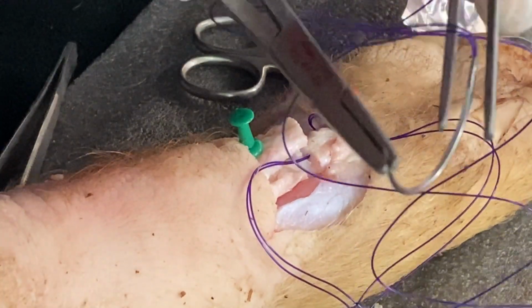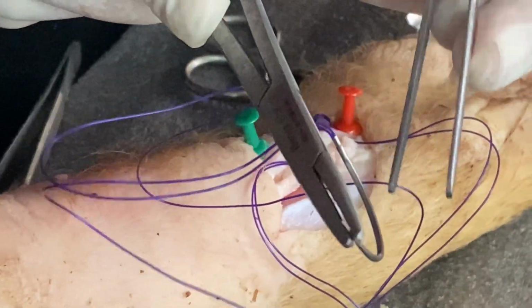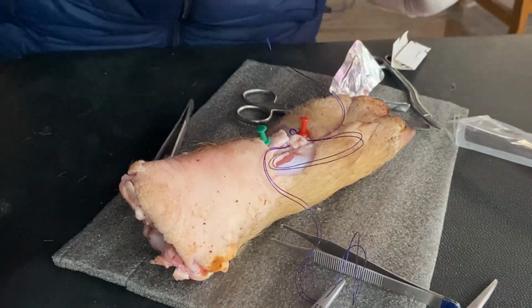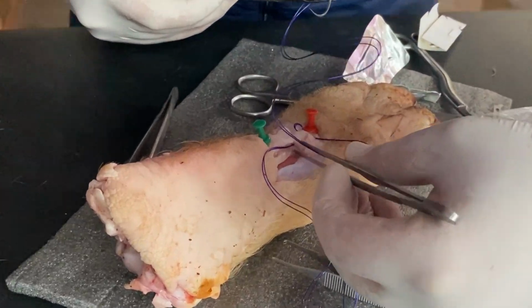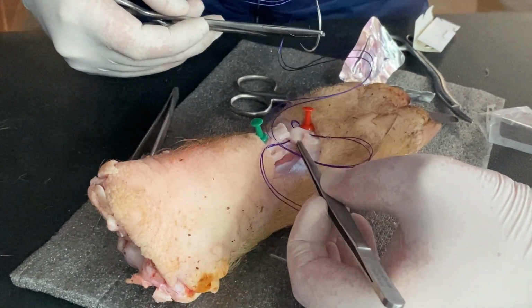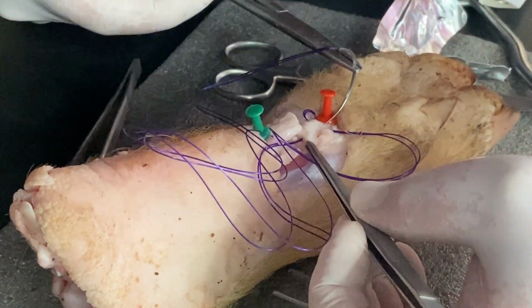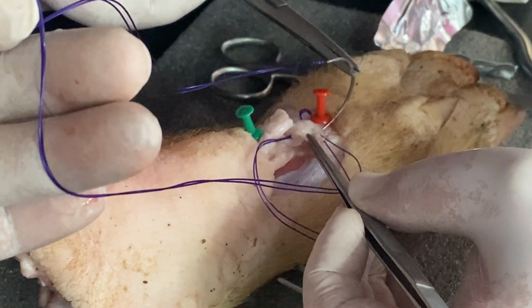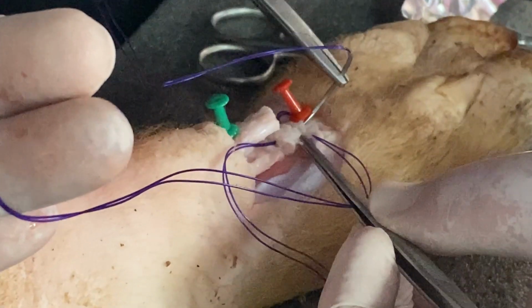Now we need to orient the needle in such a way that we can insert the needle through the tendon substance of the whole tendon. Okay. You see, I am holding the end of the tendon and inserting the needle in such a way that it will come through the tendon substance.